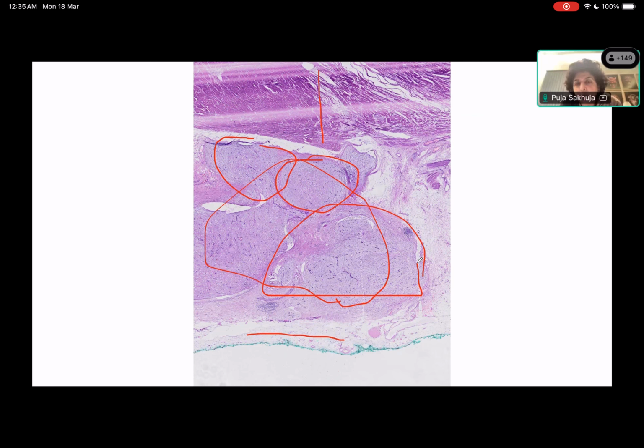Okay. So now, if I think this is a neurofibroma, what is the IHC panel that should come positive in this? S100, CD34, S100 and CD34, focally. And EMA. EMA can come positive, correct? But these were negative in this case. Plexiform fibromyxoma. Plexiform fibromyxoma. Correct, very good. Who said plexiform fibromyxoma? Chaitanya. Yes, ma'am. Okay, so this is a plexiform fibromyxoma.